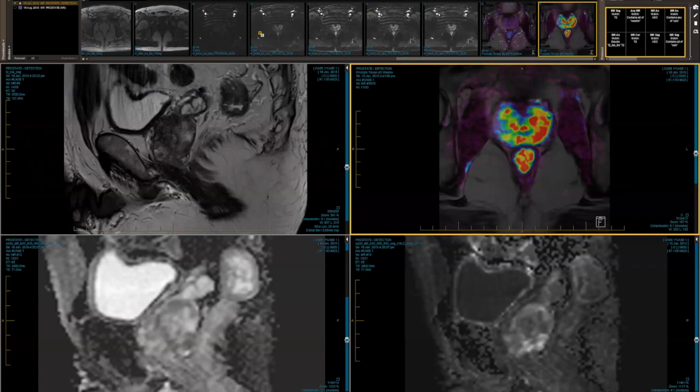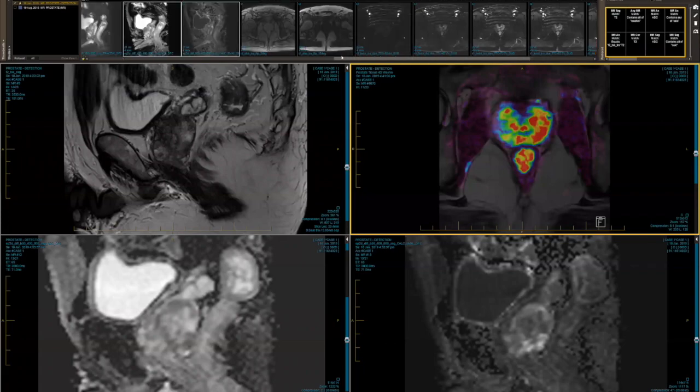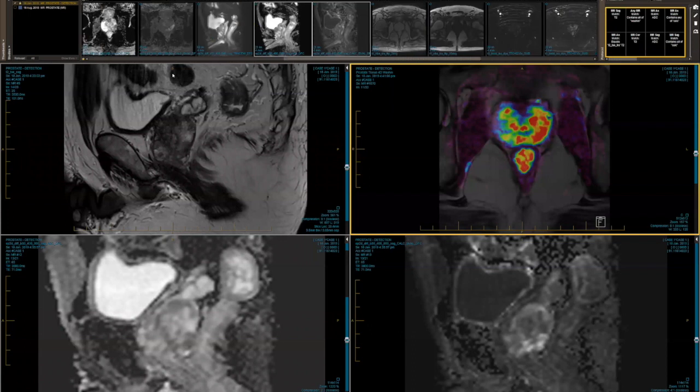Terrific. Richard, thank you. Claire, perhaps Richard, if you could keep the images up for a bit. I'd love to get your thoughts on what you do the same or similarly, what you do differently in terms of, for example, just in the beginning, is this how you acquire your prostate MRIs in the way that Richard's described?